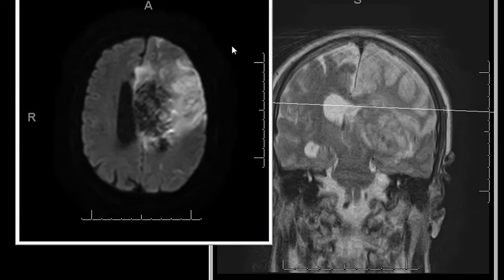The patient eventually died a few days later. For this one, I guess the patient would have died without treatment anyway. But we intervened outside the screening criteria, which is an aspect score of 6 or more. We intervened at an aspect score of 4.